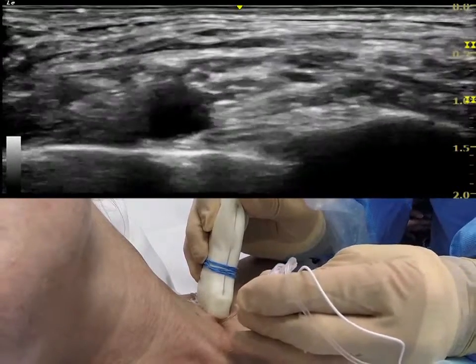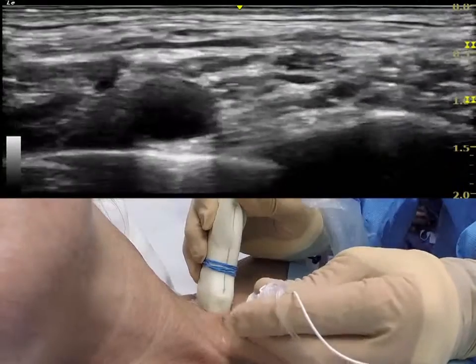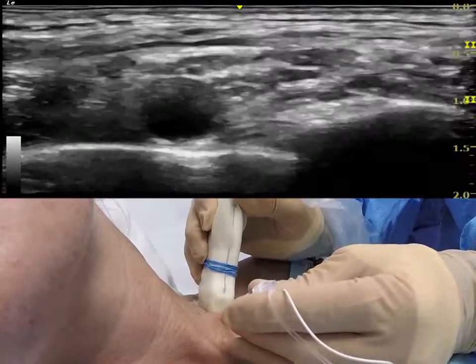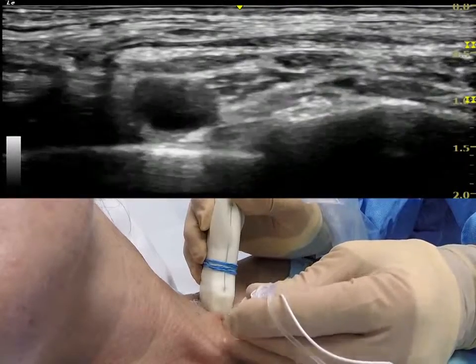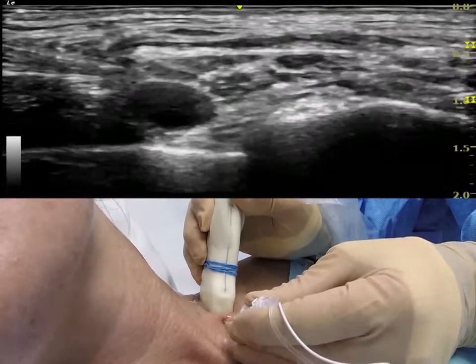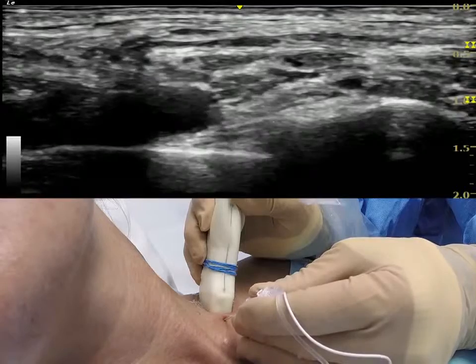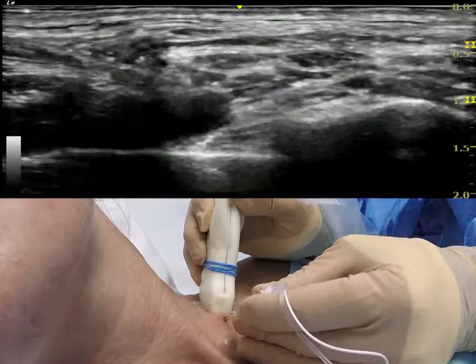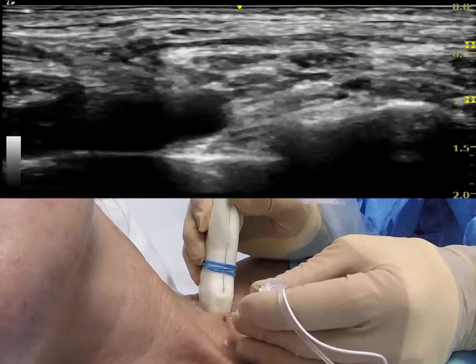In the ultrasound image you can clearly see the subclavian artery sitting on the first rib, with the pleura visible below. Note the shallow depth. The needle is approaching from the left of the image across the top of the artery into the brachial plexus sheath.